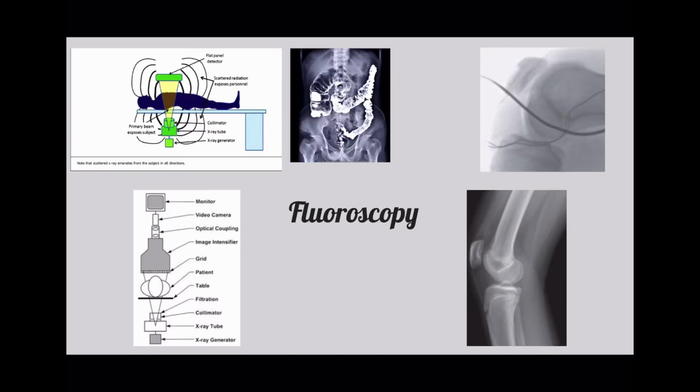When we think of radiology, many times the words X-rays, UV rays, gamma rays, and radiographer come to mind. Although this field is composed of X-rays, there is so much more to it than just these few simple terms. Fluoroscopy is the study of moving body structures and is most commonly put to practice in order to view within the stomach in the medical imaging field.